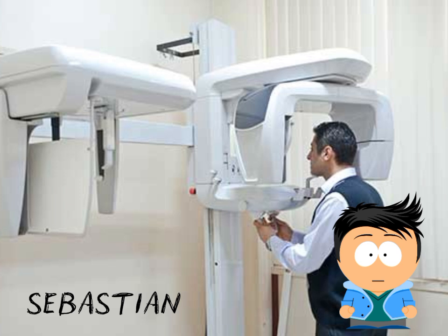During operation, the patient is positioned to bite a guide and the rotating arm is synchronized to emit radiation.